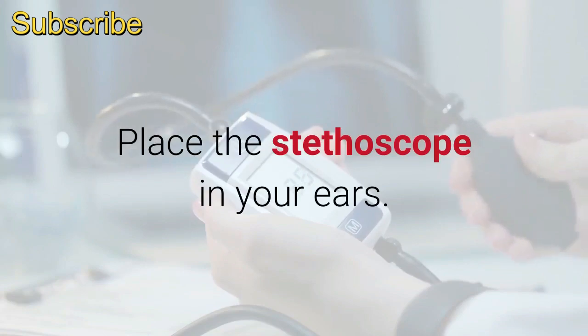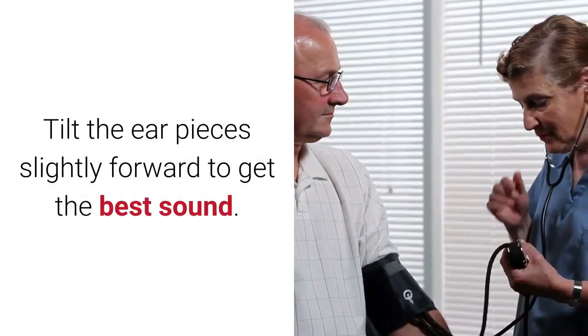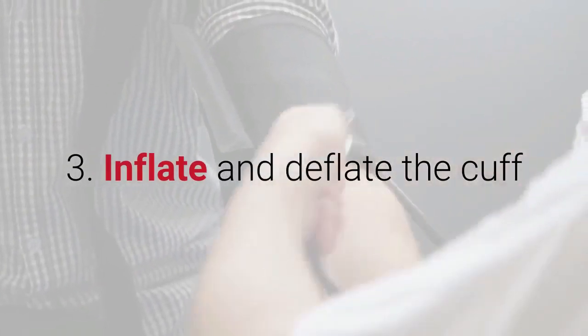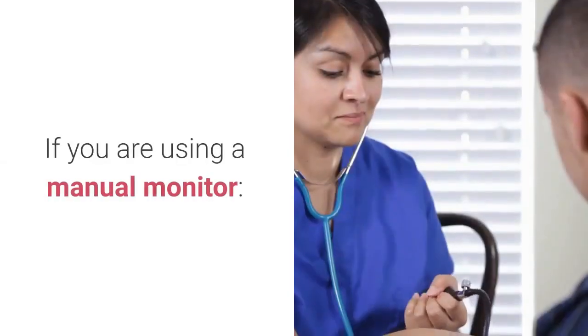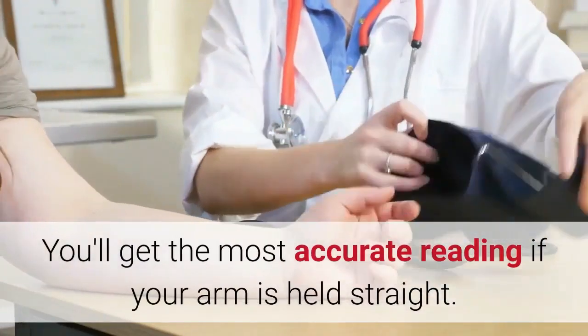Place the stethoscope in your ears and tilt the ear pieces slightly forward to get the best sound. Step three: inflate and deflate the cuff. If you are using a manual monitor, you'll get the most accurate reading if your arm is held straight.